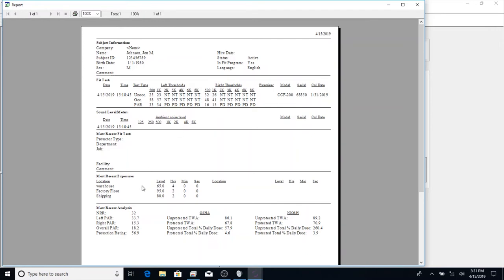If we scroll further down here, we can see the different exposure levels that we entered for John & Johnson. And continuing down, we can see the most recent analysis. The NRR is the value taken from the packaging under hearing protection.